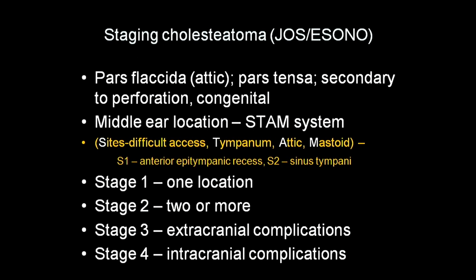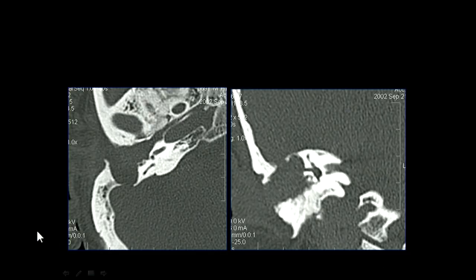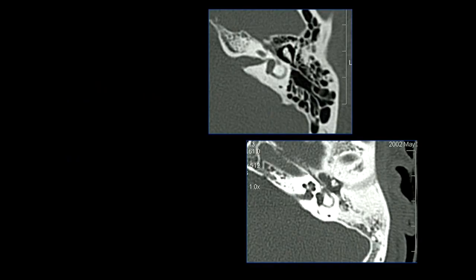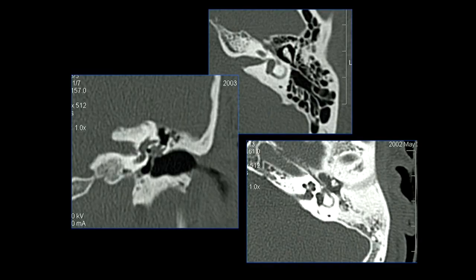I don't routinely use this staging; I just describe the findings with a dedicated paragraph for tegmen erosion and each complication — stating whether it is present or absent. Here is a patient with large soft tissue eroding the sinus plate, eroding the tegmen, eroding the semicircular canal, and forming a labyrinthine fistula. If you look for it, you will see it every time. Here the incus is intact, but the cochlea is eroded.